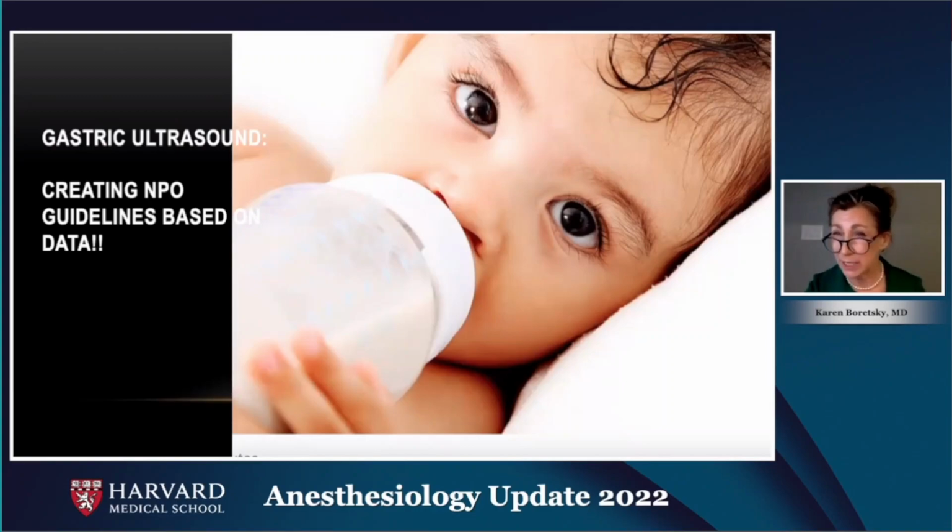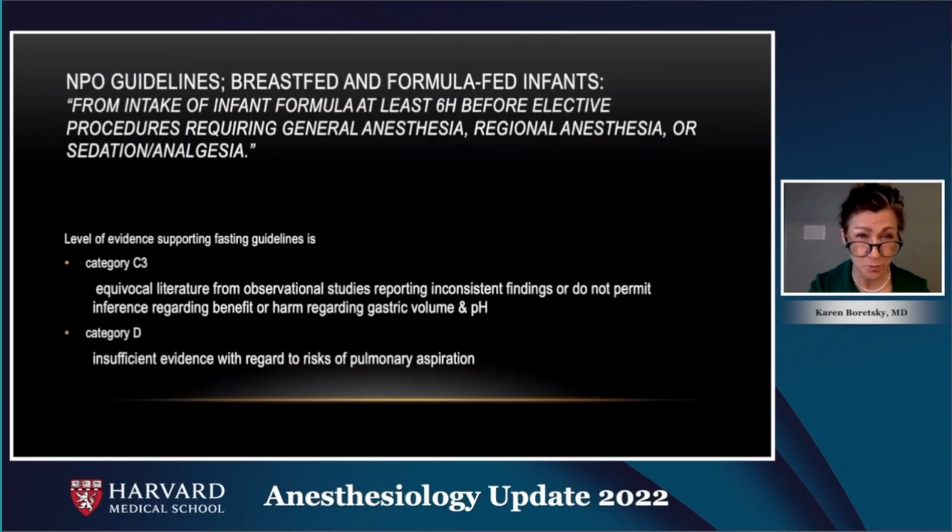For the last 9 or 10 minutes, I want to talk about using gastric ultrasound to revise some of our NPO guidelines. This is very exciting and more of a research application, but it is really going to change the way we handle NPO status in the operating rooms.